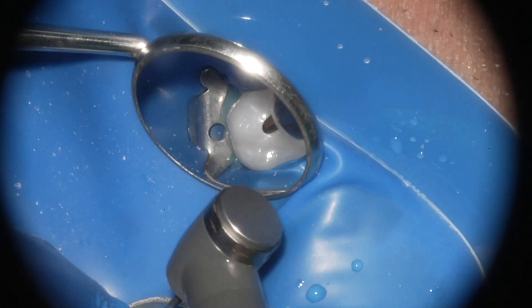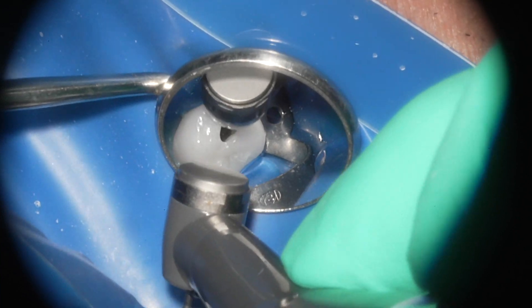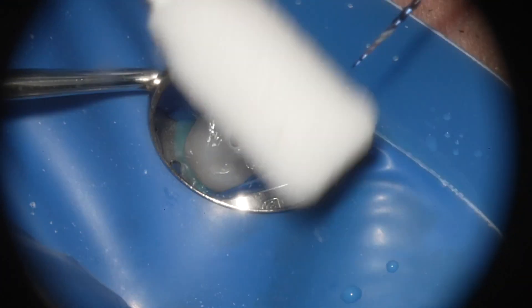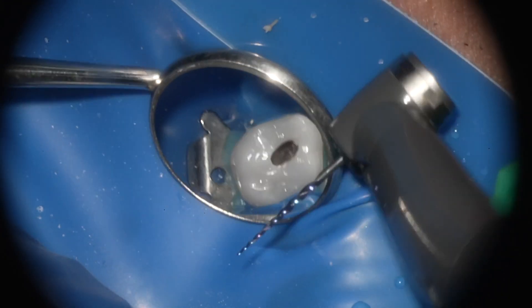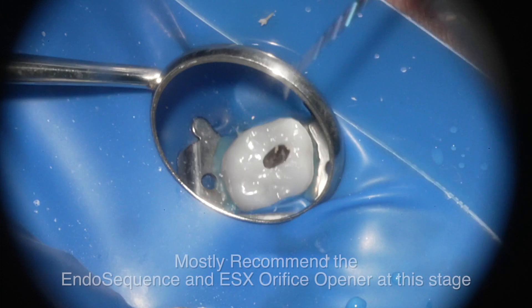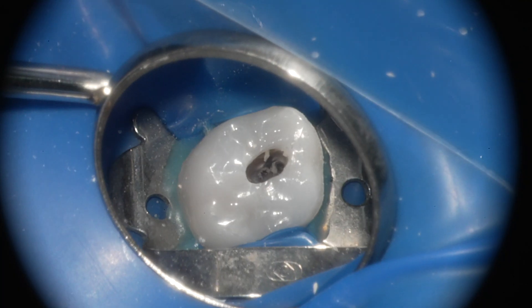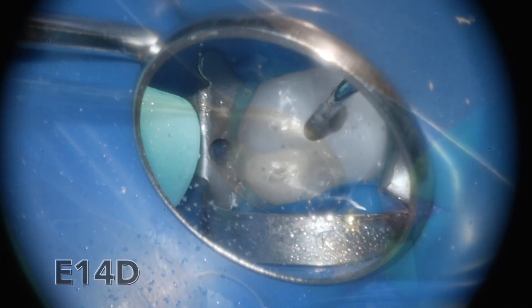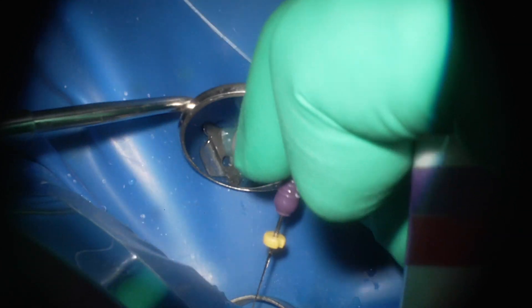The orifice opener here is actually a martensitic or controlled memory (CM) orifice opener, providing coronal pre-flaring important for a crown-down technique, ensuring the screening files and hand files can go down easily. At the MB1 and MB2 level, I often use the orifice opener almost like an explorer to find my MB2. You can see I'm troughing them, with the orifice opener taking a little bite each time, then ultrasonics to remove all the debris and calcifications.